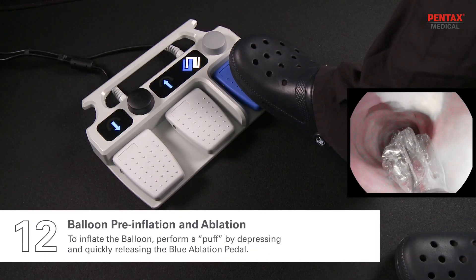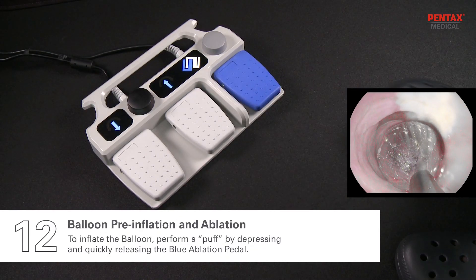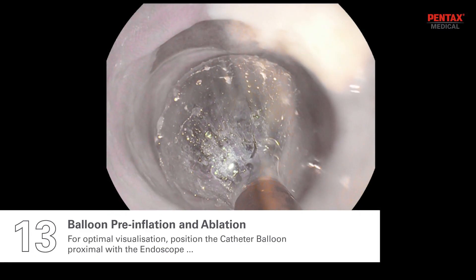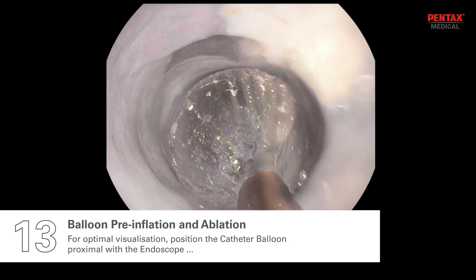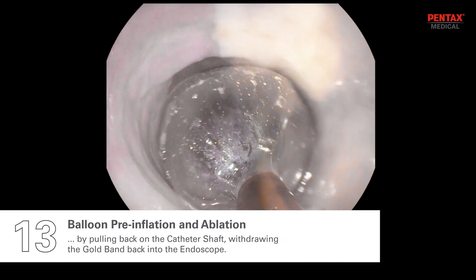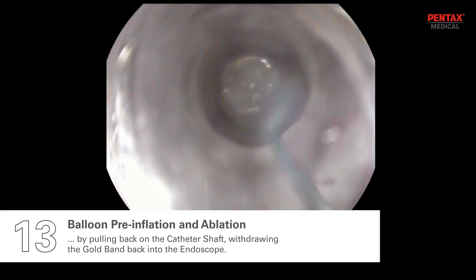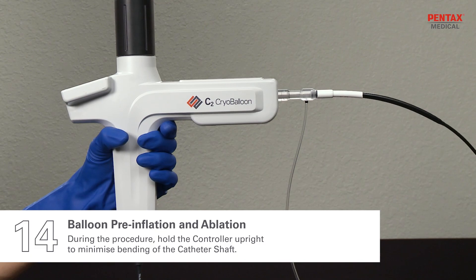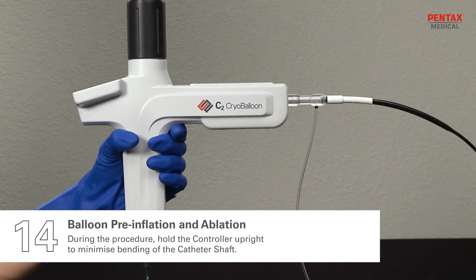To inflate the balloon, perform a puff by depressing and quickly releasing the blue ablation pedal. For optimal visualization, position the catheter balloon proximal with the endoscope by pulling back on the catheter shaft, withdrawing the gold band back into the endoscope. During the procedure, hold the controller upright to minimize bending of the catheter shaft.